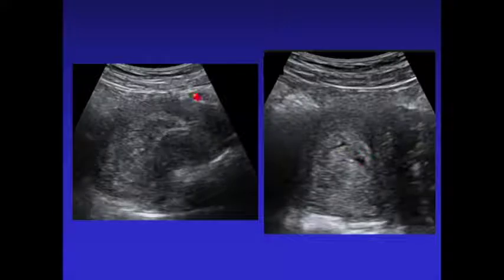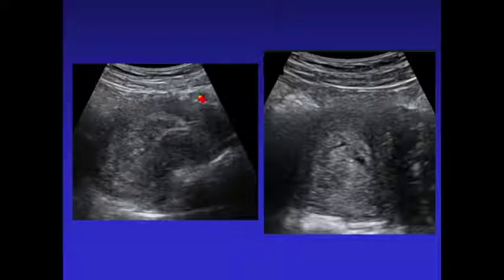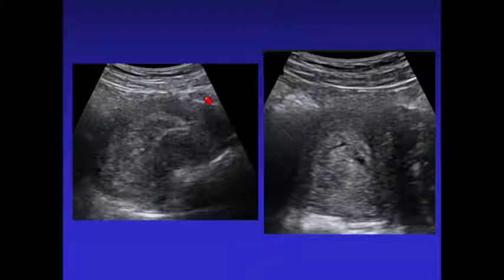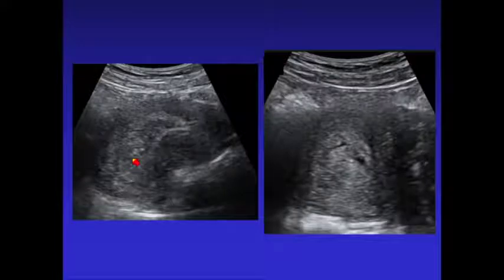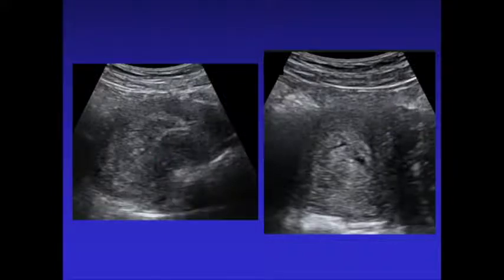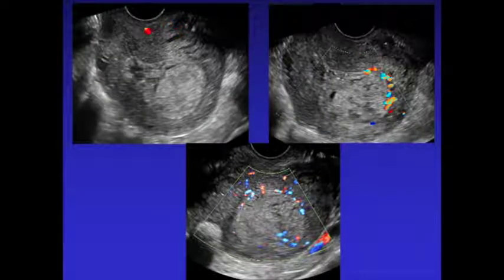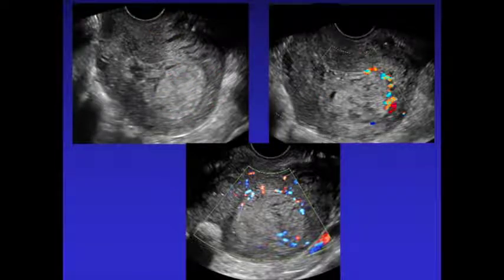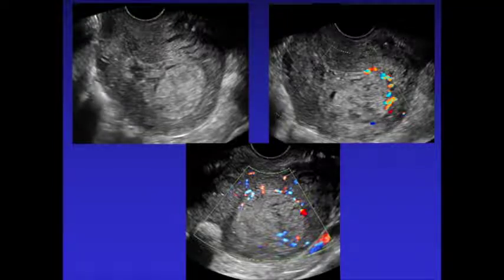We frequently start with a transabdominal scan. If patients have had a C-section, they might have a big dressing on their abdomen. Since you're going to transvaginal anyway, there's no reason to remove that dressing, but we do take transabdominal images to make sure we're not missing anything large. You can frequently see heterogeneous contents within the endometrial cavity — the question is whether it's blood products or retained products. On vaginal scan of a retroflexed uterus, you can see heterogeneous material, and turning on color can show flow going into placental tissue, confirming it clearly.